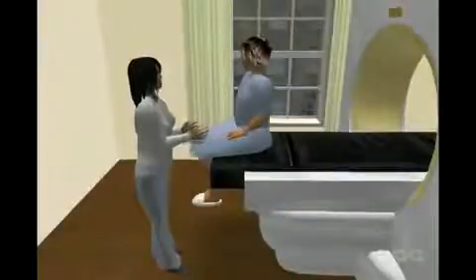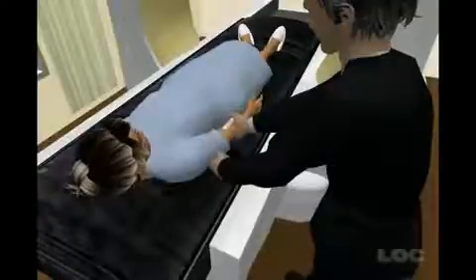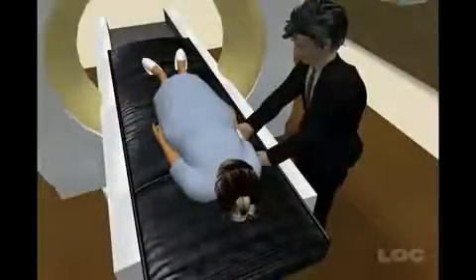The vast majority of people will not experience any sense of claustrophobia. You'll be helped onto the scanner couch by the radiographer. These days, most people go into the scanner feet first. Before the scan starts, a small needle will usually be inserted into your arm for the injection of a contrast medium. This is a liquid that enhances the definition of the scan.